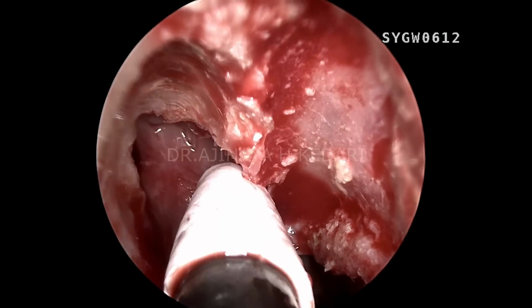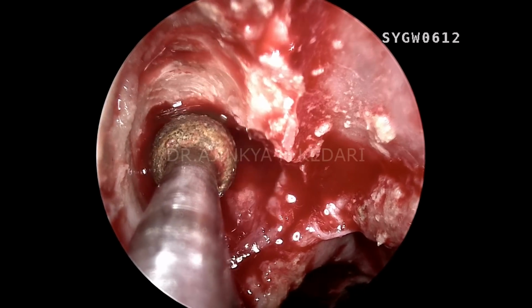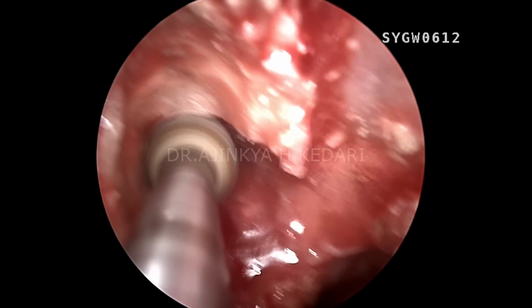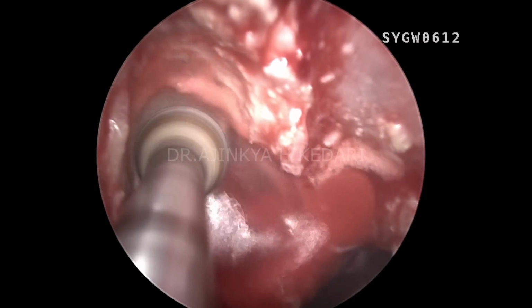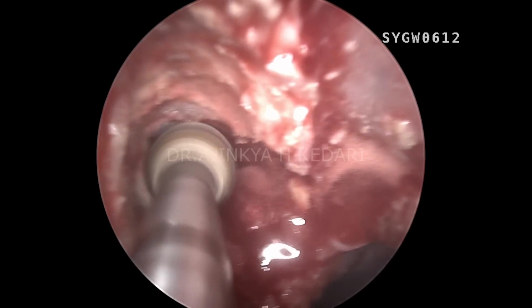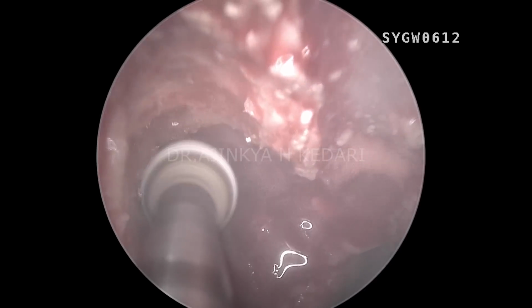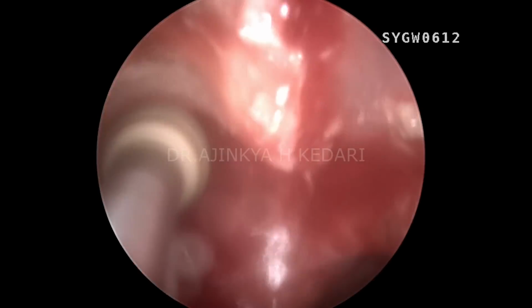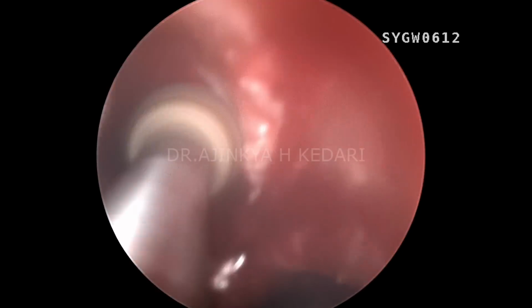So you can see that is all the posterior wall of the frontal sinus, and you can actually see the CSF leak coming right from there. I'm resuming with my drilling, just trying to carefully finish off the lateral touches till I reach the skin on all sides. You need to be very careful of the posterior wall of the frontal sinus, because exactly behind that will be the frontal lobe of the brain, which you do not want to damage.